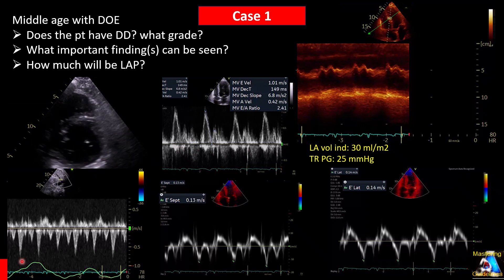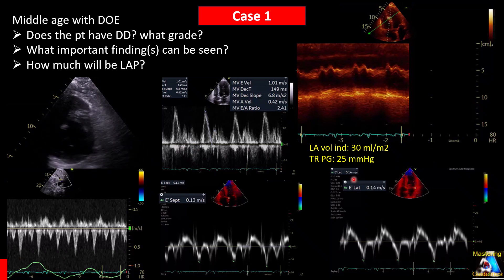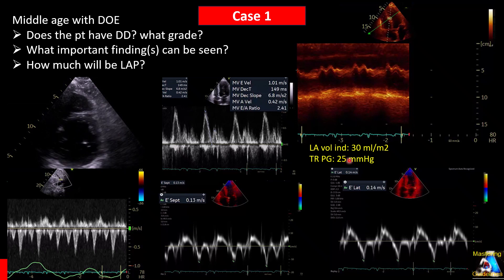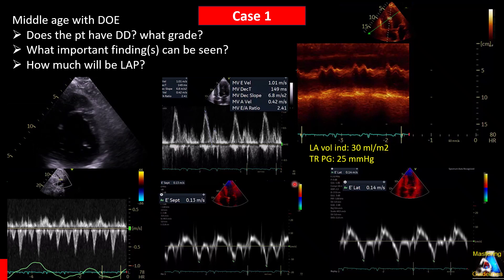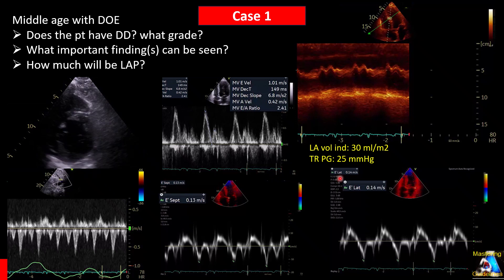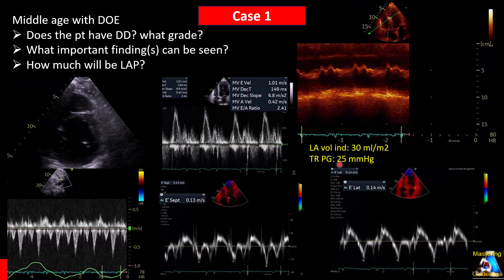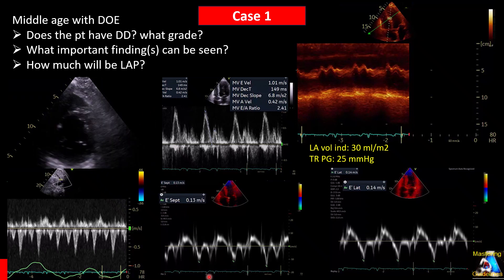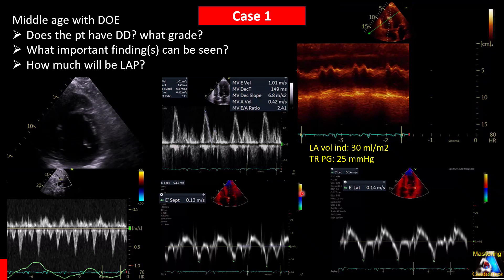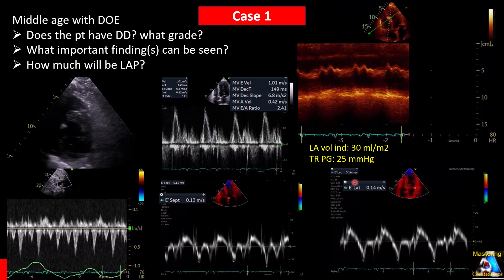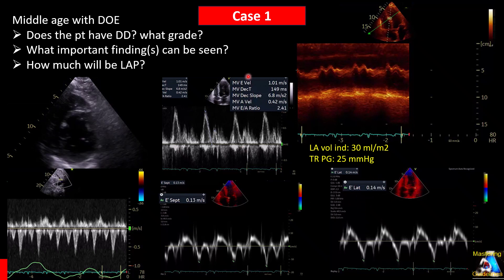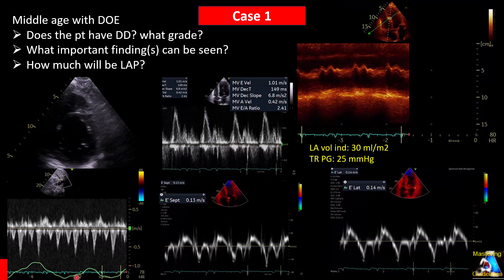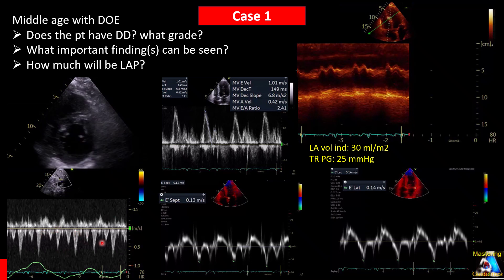For more information: left atrial volume index is 30 milliliters per meter squared, and tricuspid regurgitation pressure gradient was 25 mmHg. Here we have numbers for e-prime — both septal/medial and lateral — along with those other parameters. And here is the middle hepatic vein Doppler.